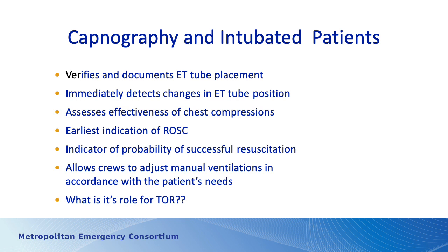There has to be some discussion about what's the role of capnography with termination of resuscitation. A couple of years ago, we relied on it heavily, and then we realized that as we got better at providing CPR for the patient, we had higher CO2 values, even though the patient was still in cardiac arrest. So we have changed our clinical standard on termination of resuscitation to capnography being something you can consider as part of your decision, but it's not an absolute.